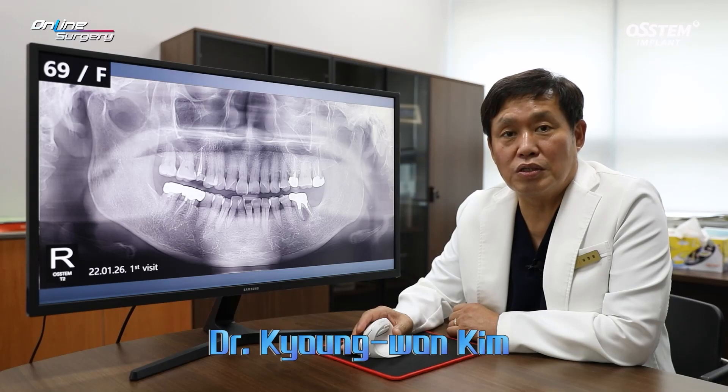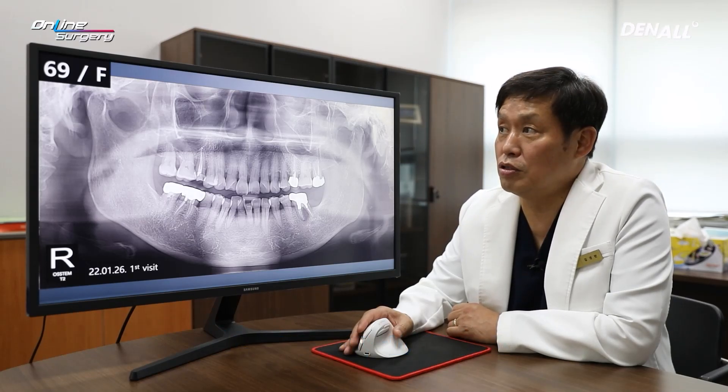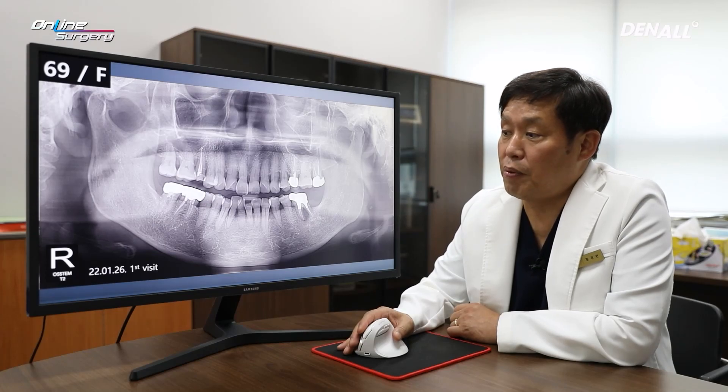Greetings, I'm Dr. Kim Kyung Won of Online Surgery. I am honored to meet you through Online Surgery. This is the patient of the day.